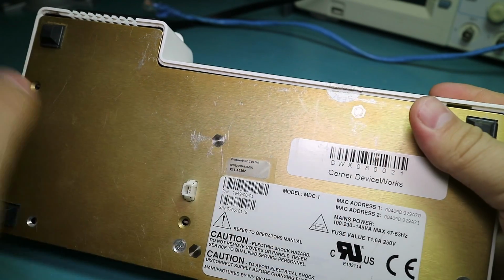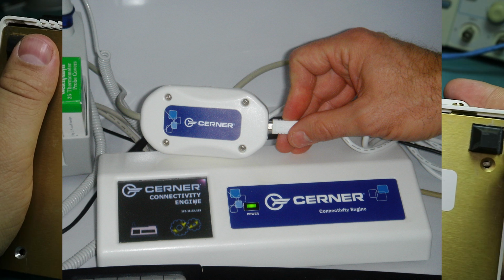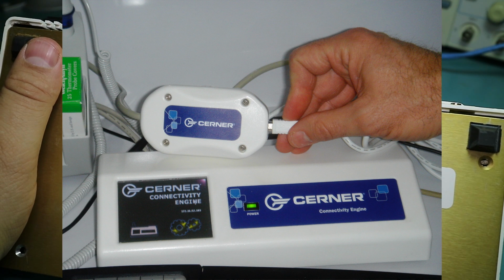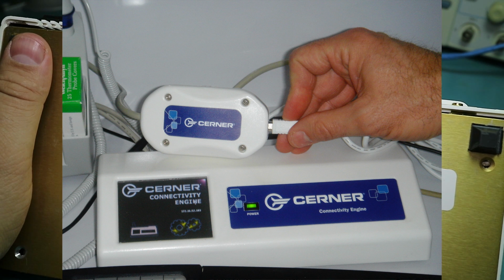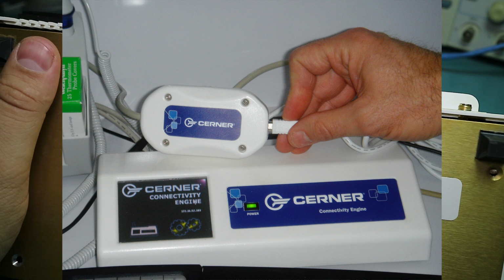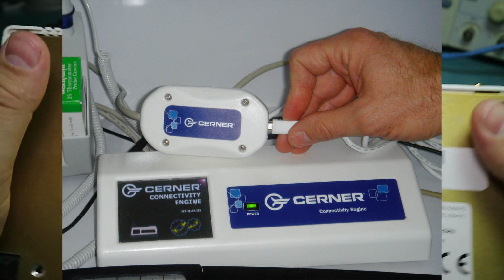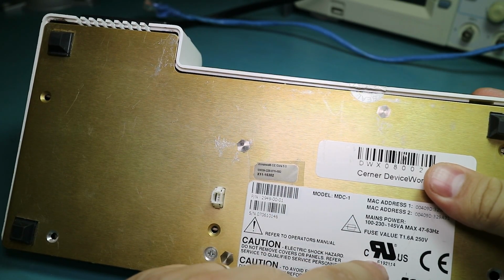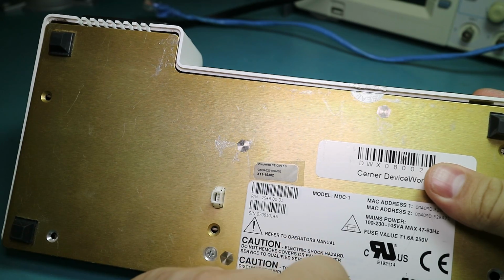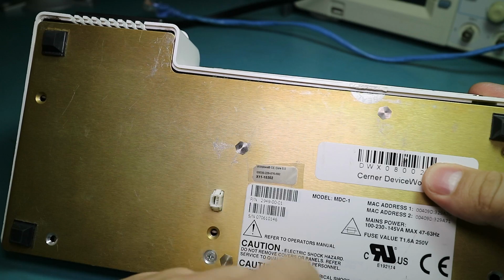I have found a picture of this thing in operation. It was on a guy's Flickr account, and it shows some kind of small device. At first I was thinking it was like an ECG unit or something, like maybe it was actually reading stuff directly from a patient, but it might just be a fingerprint scanner or something, I don't know. Its screen was different to mine, so I don't know what the deal is. Maybe there's different software for this demo unit. It's just not set up properly.